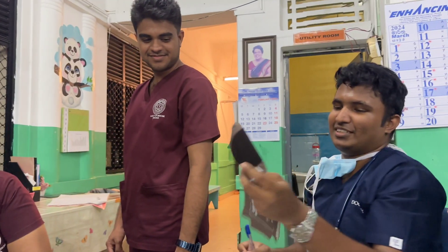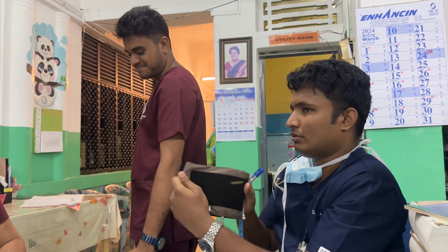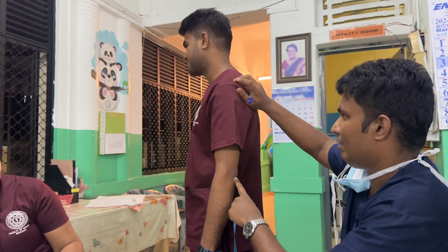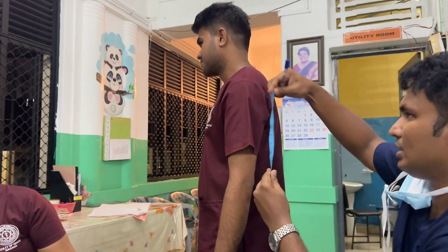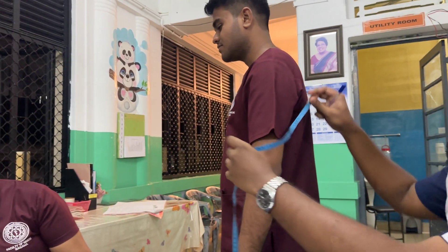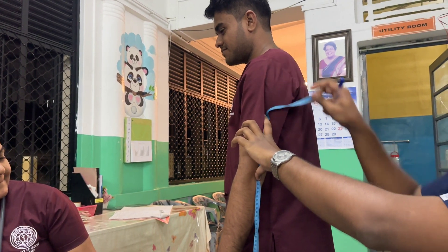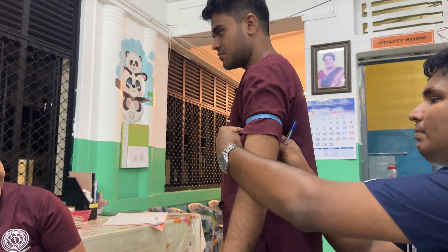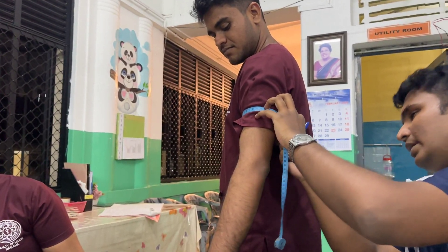Now I'm going to explain how to choose the appropriate bladder size to measure blood pressure. For that, we have to measure from the acromion process to the olecranon process — the length is 32 cm. Then we take the midpoint, which is 16 cm, and from there we measure the upper arm circumference, which is 29 cm.